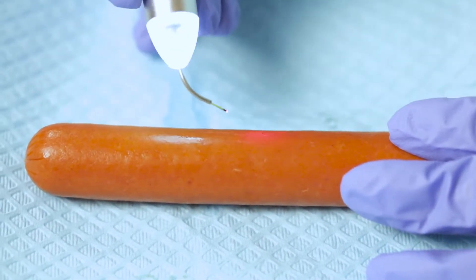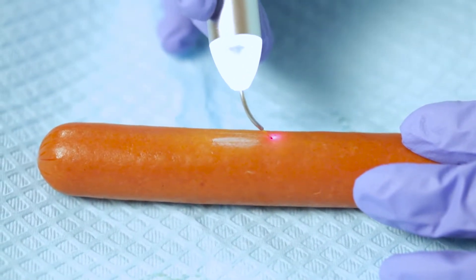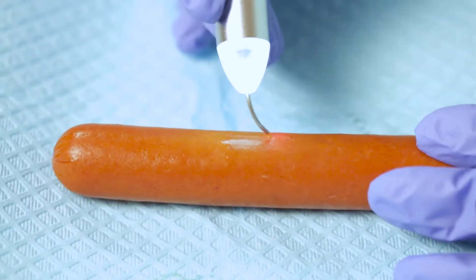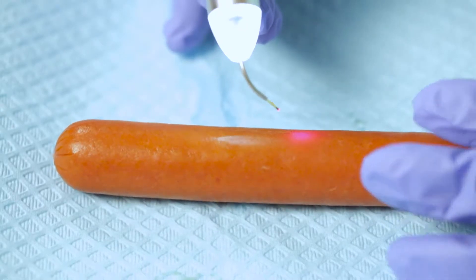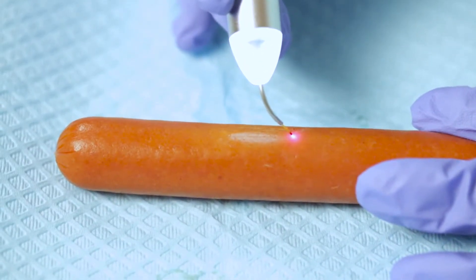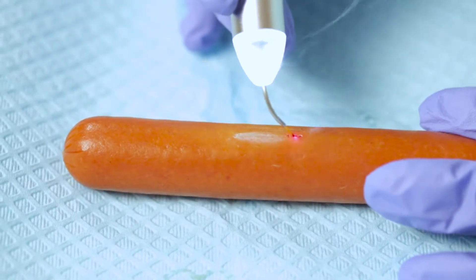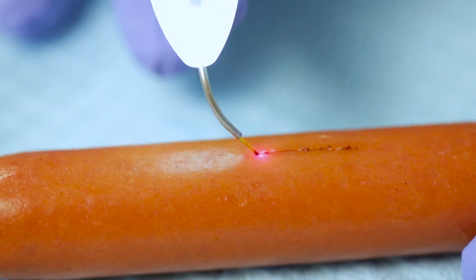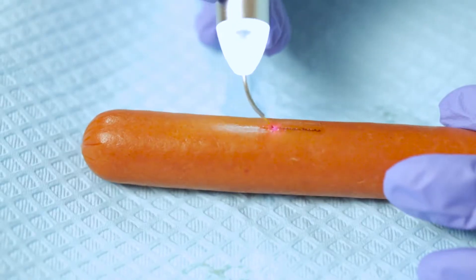I can actually bevel tissues, but it's not great for cutting. You do want to hold it more perpendicular. If I try to move it too fast or press down too hard into the tissues, then I'm more ripping through tissues rather than allowing the laser energy to do the work. The proper technique would be to touch the tissue, press your foot pedal, and allow that laser energy to heat those molecules up to 100 degrees Celsius. It's a very light feather touch stroke — let the laser energy do the work for you.